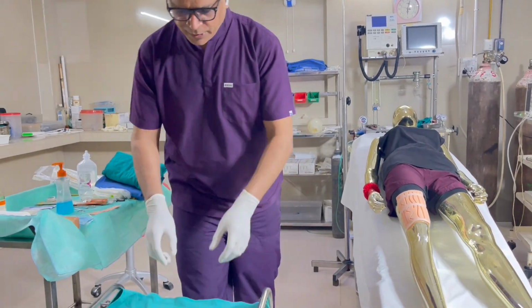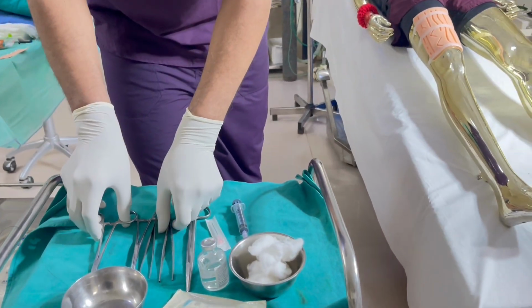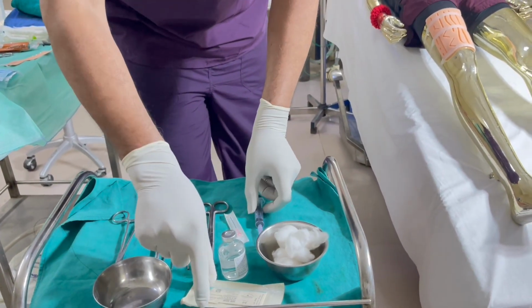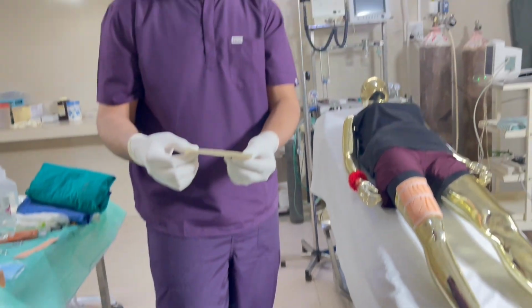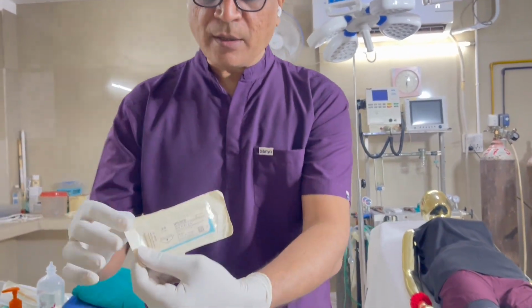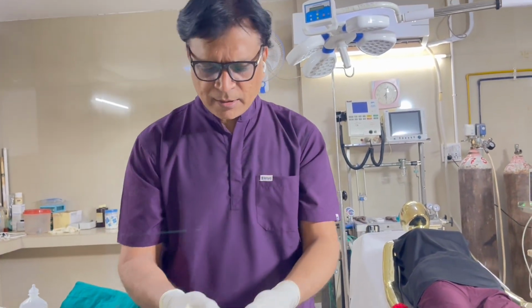Then see for the instruments. There is needle driver, forceps, plain forceps, tooth forceps, suture cutting. There is suture. So first of all, I check the suture. So can you check this? Its expiry date is around 29. So I confirm it and check the proper suture.